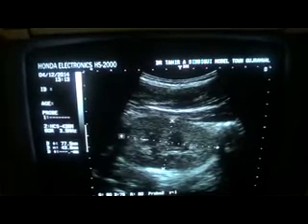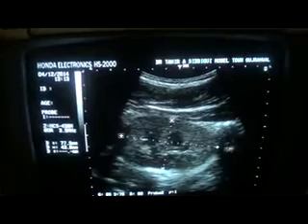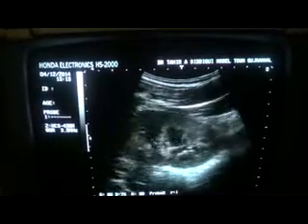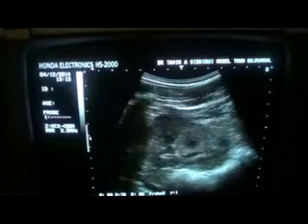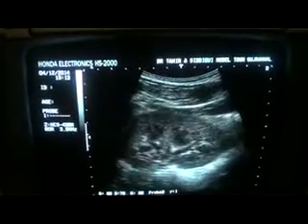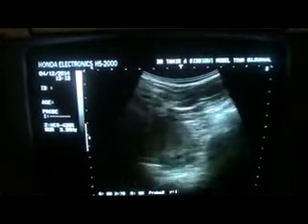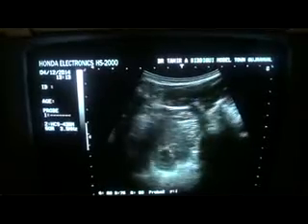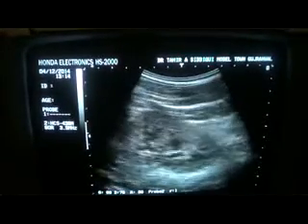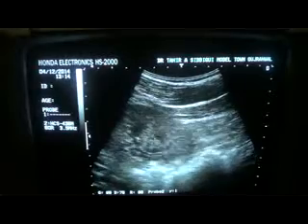Pyramids are prominent, no central sinus echo complex, no focal lesion, no calculus seen. So this case is very much consistent with bilateral renal parenchymal changes, and interstitial nephritis cannot be ruled out in this patient.